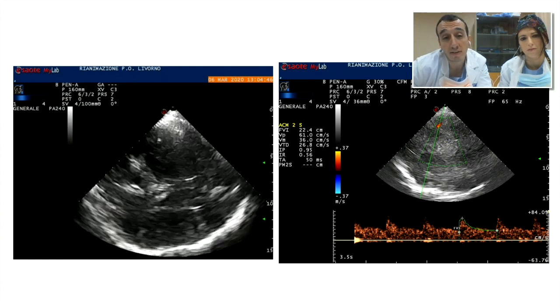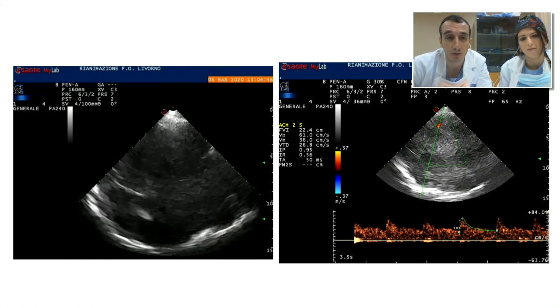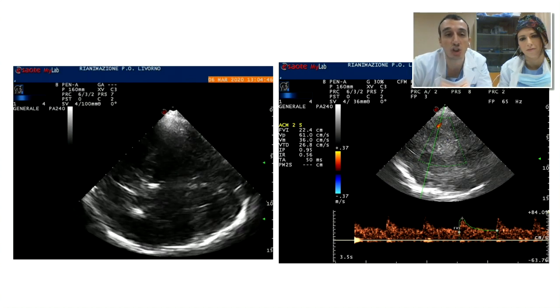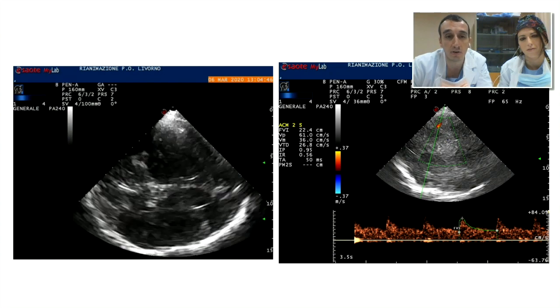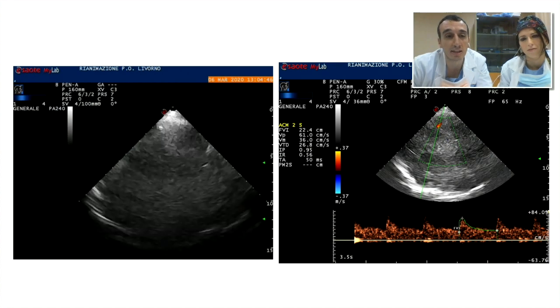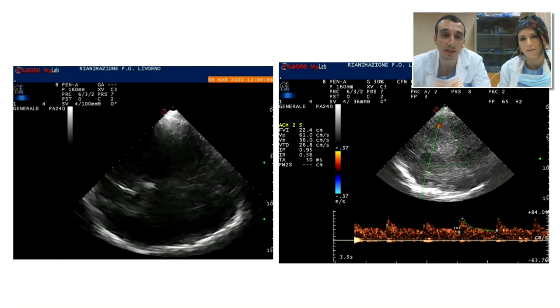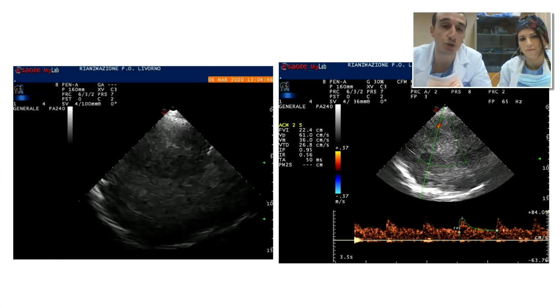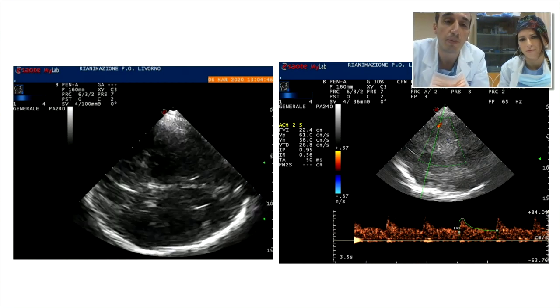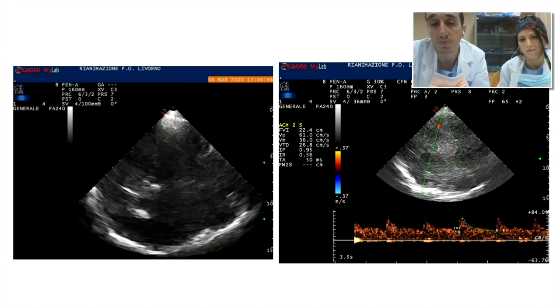Maybe you don't have a very good image, but you can do a differential diagnosis with midline shift of the brain, or hernia, or hemorrhage. So I think that if you have a device that can do this job in your department, use it in this situation, because it's very important to monitor the patient and the cerebral flow too.